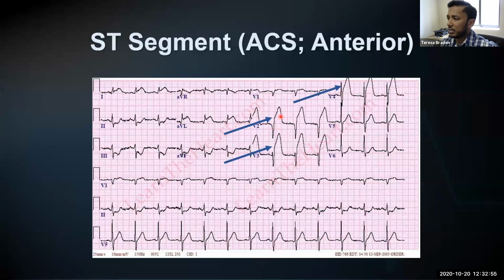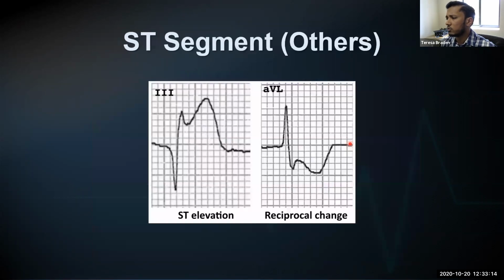And if we saw ACS in a patient, ST segment elevations in leads V2 and V3, that tombstone type appearance, even going into V4, then we look for reciprocal changes, and we can see that there are some reciprocal changes even in leads 3 and aVF, as well as some in V6. So let's go back.